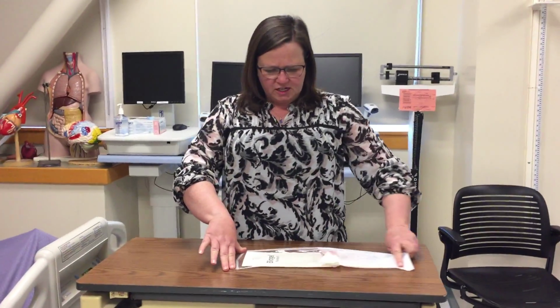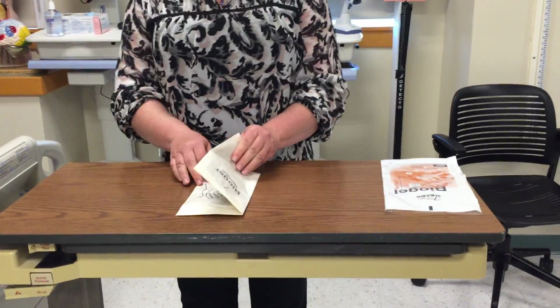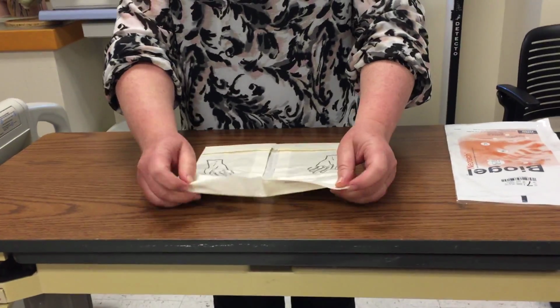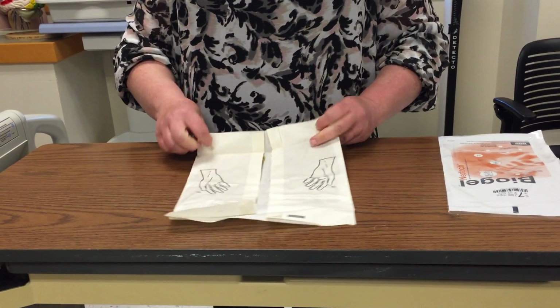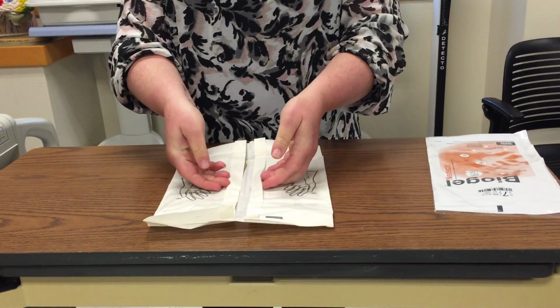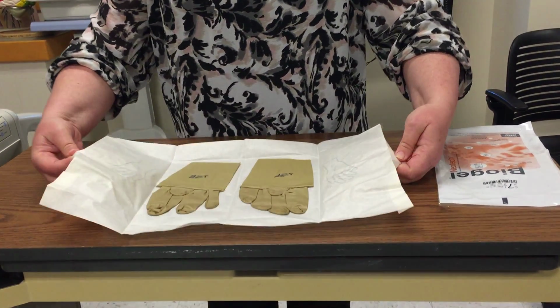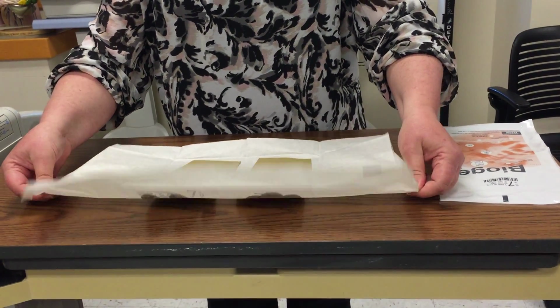Now open the package carefully, take them out, and you're allowed to touch this part. What you don't want to touch is the gloves themselves. You can open this here. The paper is going to want to fold back on itself, so I find it's easier if you just do a little half fold that way and a little half fold this way. And now I'm going to open right here. The outer inch is safe to touch, but anything inside the inner inch is not okay.